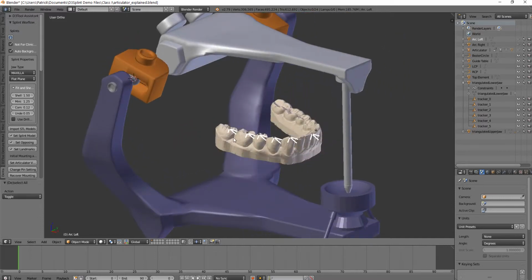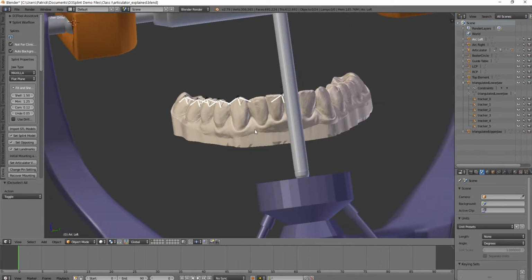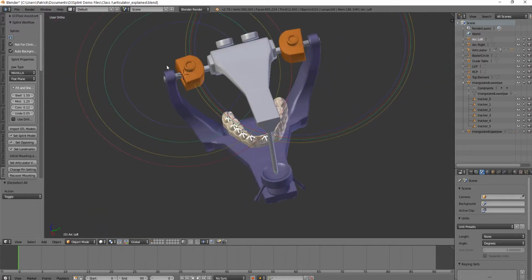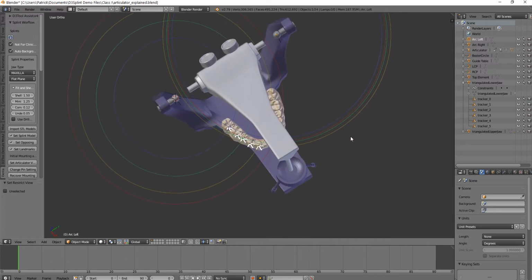Now we're going to look at this articulator's motion and do a couple cusp tip tracks to see if the behavior matches our expectations. So what I've done is I've placed two sets of arcs around each condyle position. This one is centered around the right condyle with the big rings, and this one is centered around the left condyle with the tighter rings.